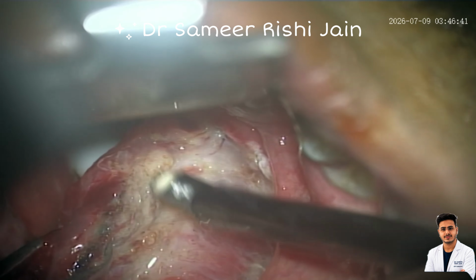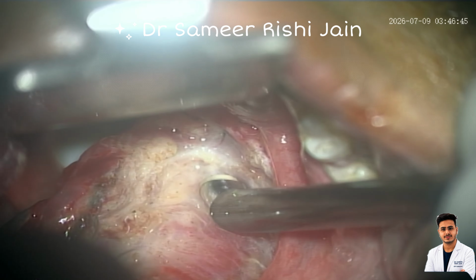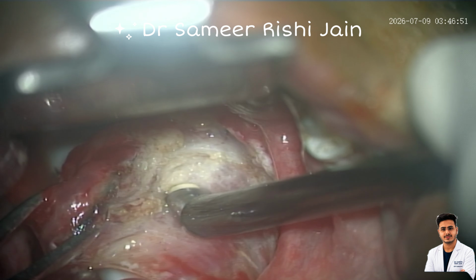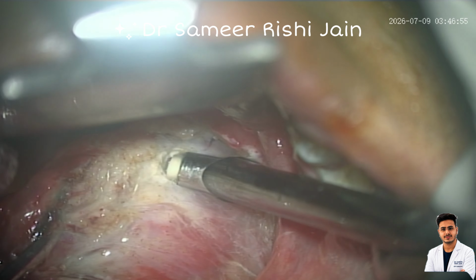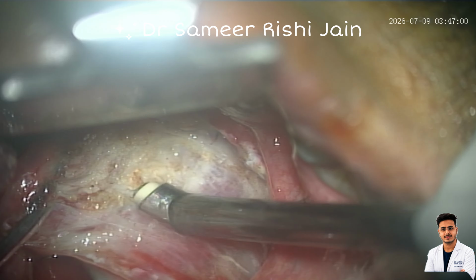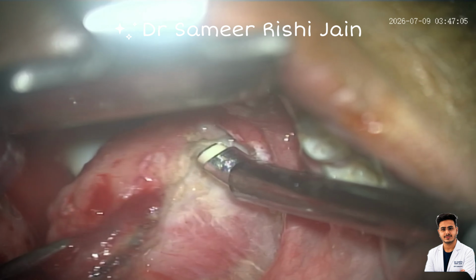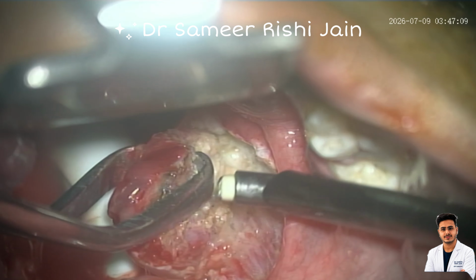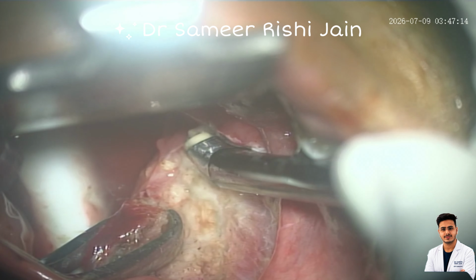So you can see I am doing a prophylactic coagulation in the area of the tonsillar artery. This area is approximately where the tonsillar artery enters the tonsillar tissue. The tonsillar artery has a large caliber in the lateral aspect of the tissue. As the artery goes medially, the caliber of the artery decreases. So the chances of the bleeding are less when we first coagulate and dissect at the medial most part.